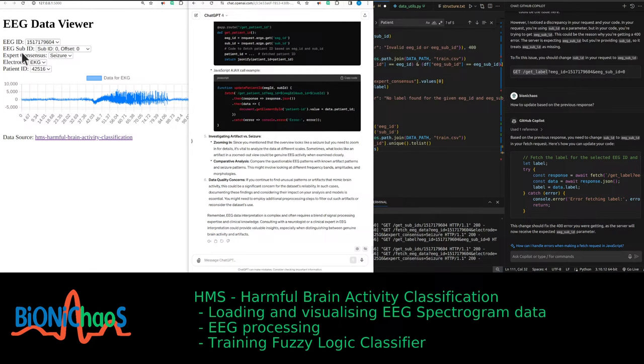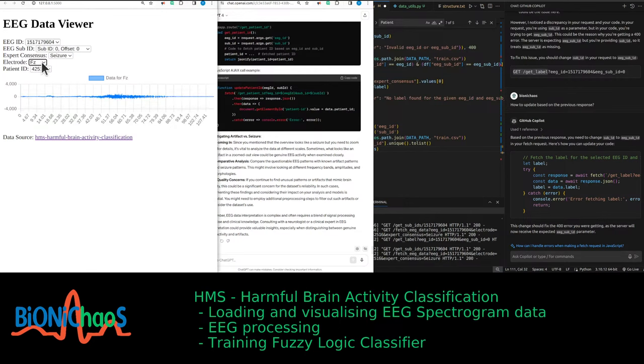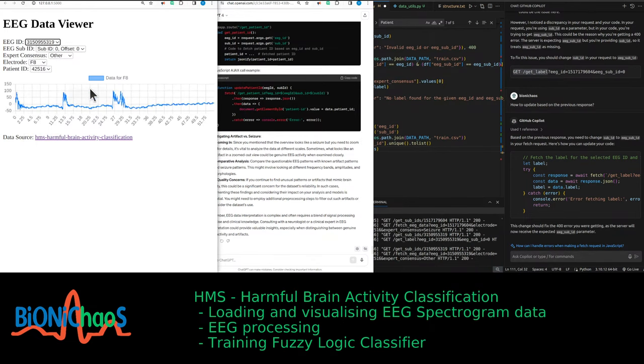We have an option to add a channel so we can compare one of the EEG to the ECG side by side. Or should we just continue to the spectrograms? I just suspect there's something wrong with this dataset altogether. There's a lot of weird things. I can do a summary, but I found at least two or three major red flags. I keep finding red flags, like this one.